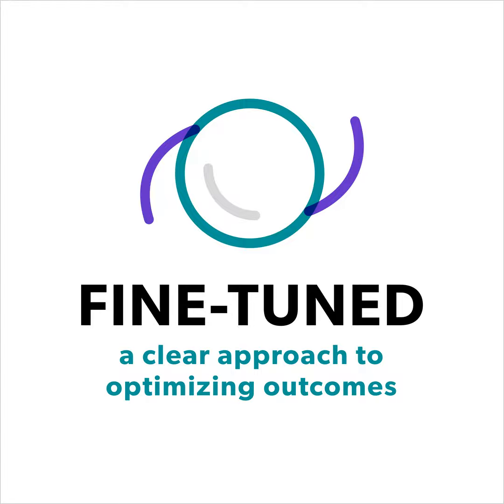Previously, I developed an instrument that has a pendulum and it marks the cornea at 0 and 180 degrees. We placed black pin marks over the radial violet mark to make the corneal marks. The marks with the pin do not transfer easily from the marker to the corneal limbus. The marks took more time, and they were not as precise as they are with the CATALYS laser.